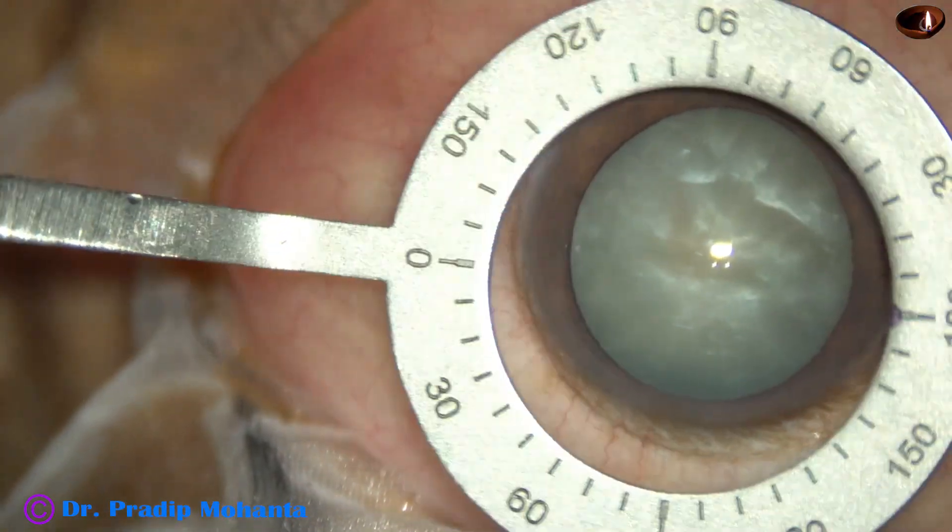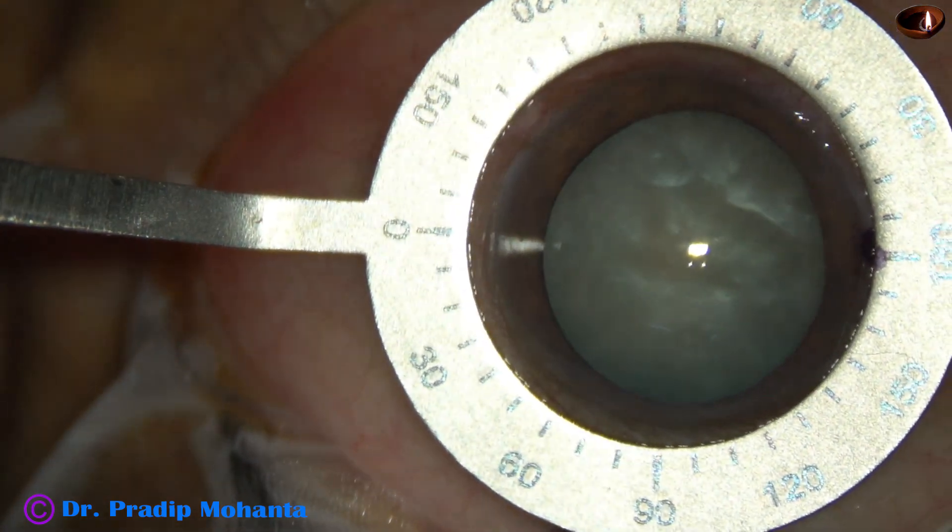First, I am going to mark the 0 and 180 degree axis.